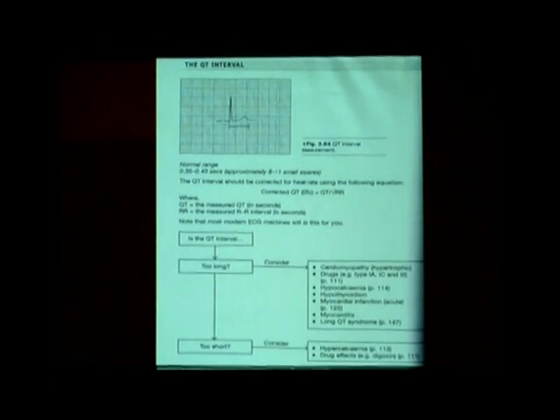So whenever there is syncope in children, whenever there is syncope in an adult, always make sure you look at the QT interval, right? Syncope and fits in children, always look at the QT interval. Many times they will be taking anticonvulsants for years without anyone looking at the QT interval. So recurrent syncope and fits may be due to Stokes-Adams, or due to torsades rather than epilepsy.